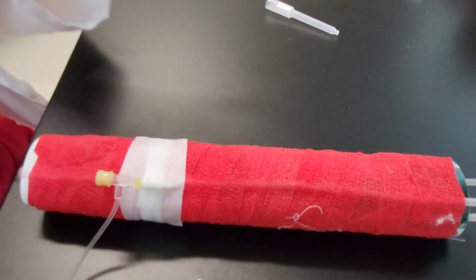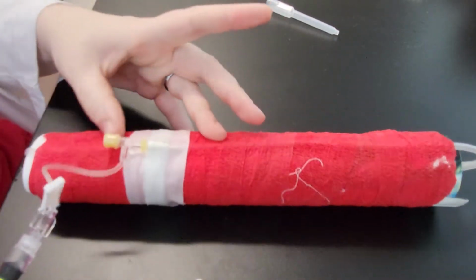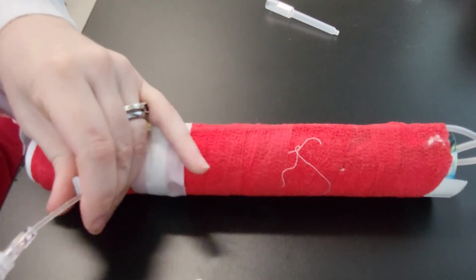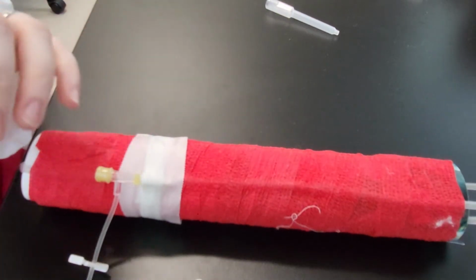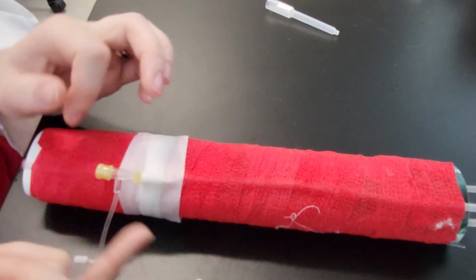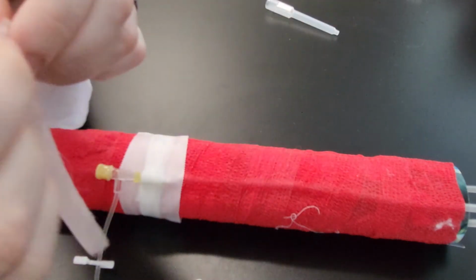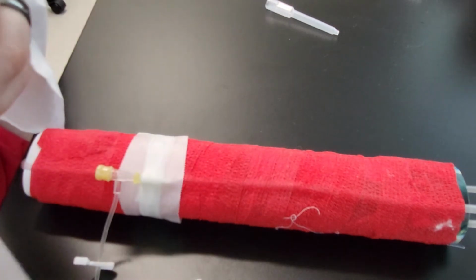It's always good while you are placing an IV catheter to flush periodically while you are placing it to make sure that everything is still patent, there's been no movement. If the patient is moved, we want to make sure that there's no issue with the catheter. So at this point, you guys saw that my T-port kind of fell out. And in order to avoid that, we use the piece of tape. It is our second piece of the little 1/2-inch tape that we ripped earlier.